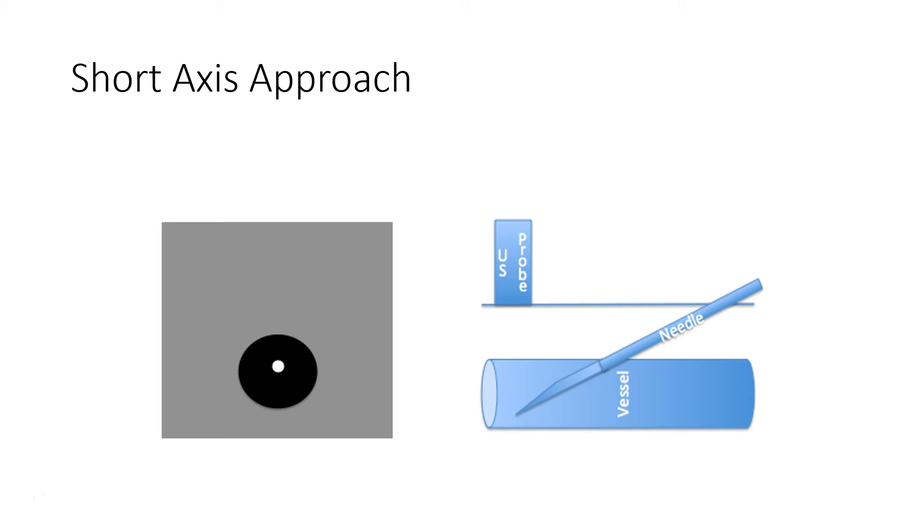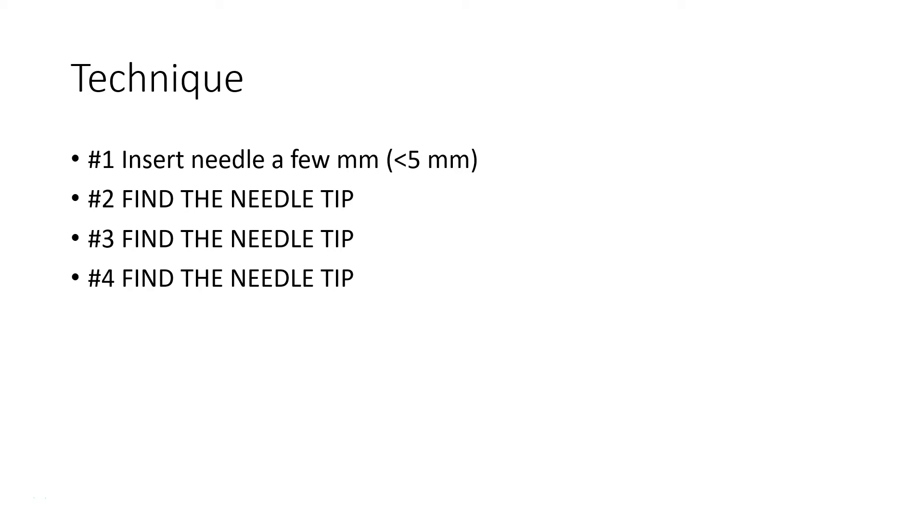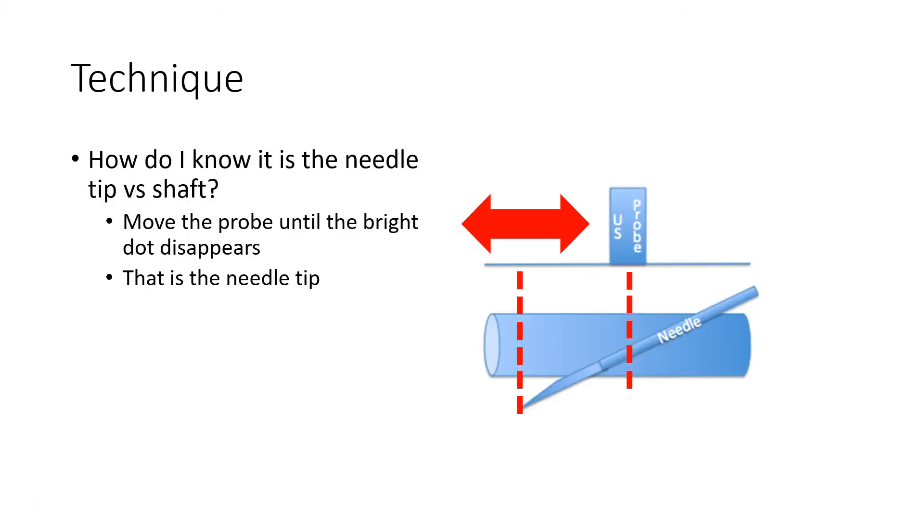A common mistake when people first start out is they get excited and retract the needle as soon as they see it's in the vessel, and then they discover the catheter begins to slide out. In real life, you want to insert that needle a few millimeters, find your needle tip, and really make sure you've found your needle tip — because if you advance without knowing exactly where your needle is, that's how you hurt someone. The reason to lose sight of the needle tip as you move is to ensure you're not seeing a different part of the shaft. The needle shaft all the way down to the tip looks identical; what distinguishes it is that the dot disappears — and as it disappears, you know you're at the end.